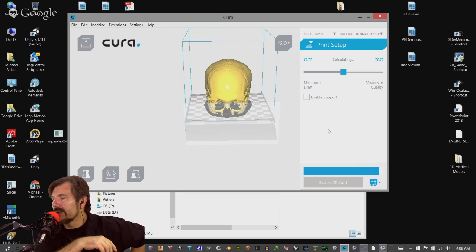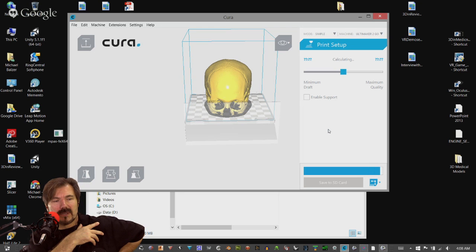But there's another one out there, and I wish I remembered the name. We talked about it. He used it to help his veterinarian print out the knee area for his dog, obviously dogs have bones as well, and they were able to use that. Now the guy's going to go off and do a talk, and he's going to ask me to be part of it. So obviously there's a big role in other things besides human in this type of stuff.